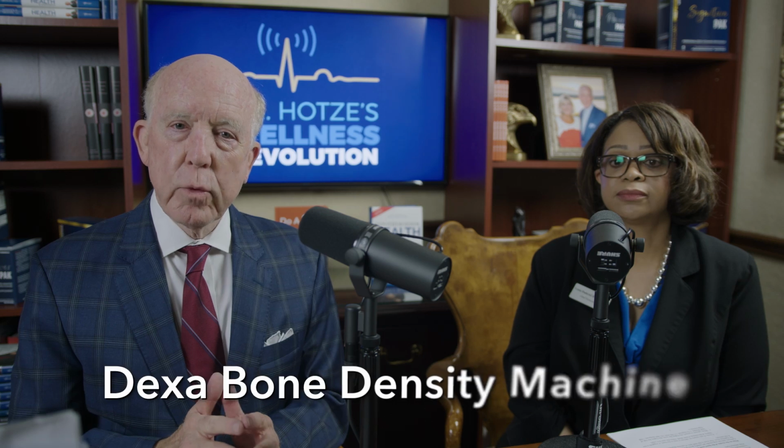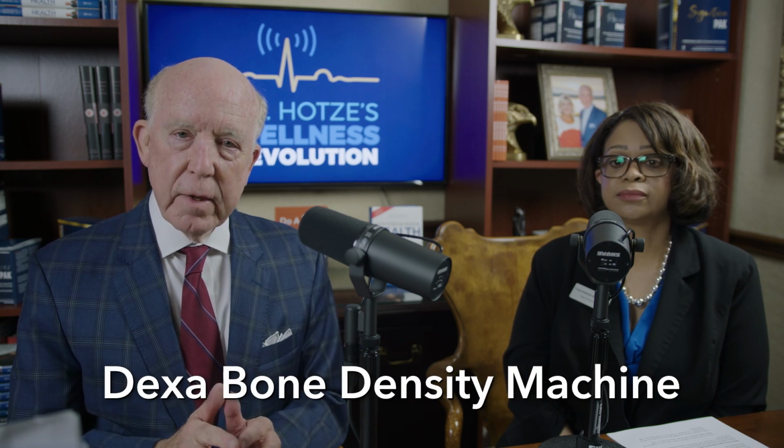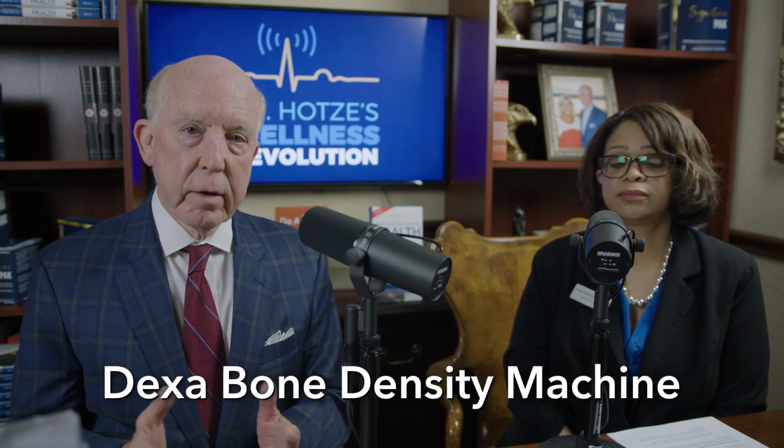And then we also have a DEXA bone density machine, and that measures the amount of calcium and the strength of your bones to see if you have any osteoporosis or osteopenia, or whether your bones are strong or not. And this is what Lesia operates here at our center on our guests. So the first thing we'd like to talk about is computer CT scans.